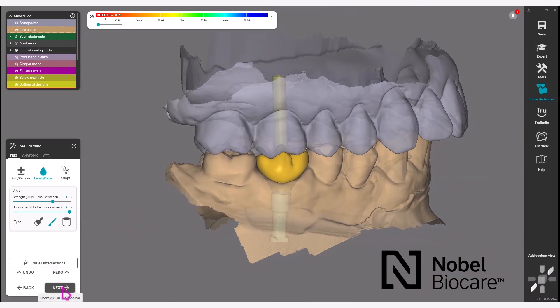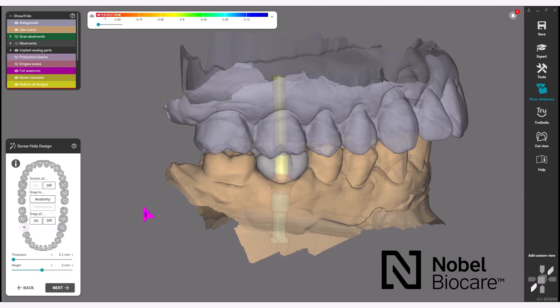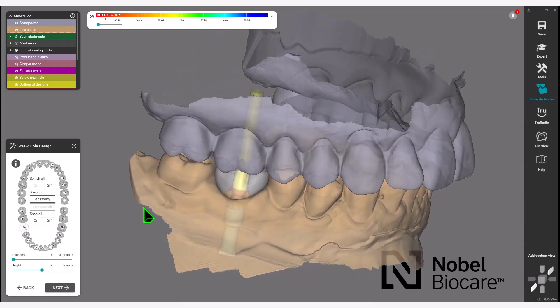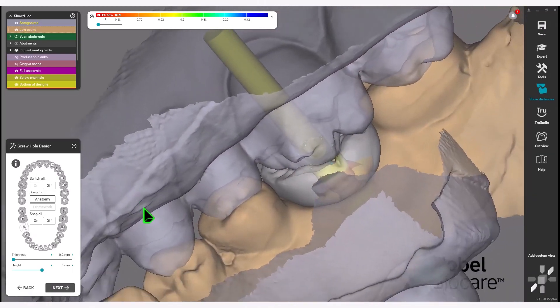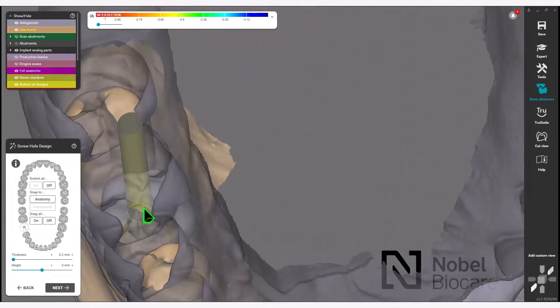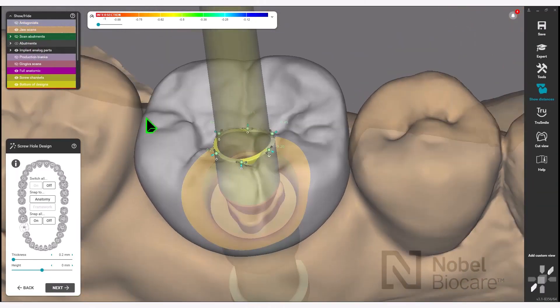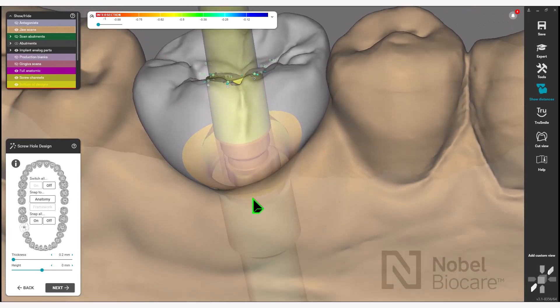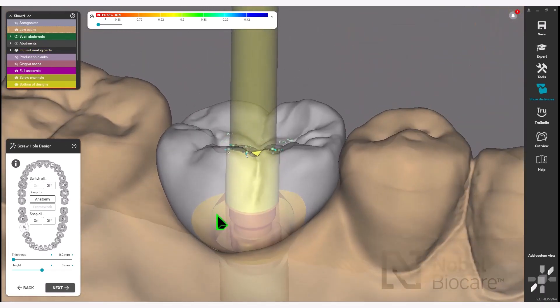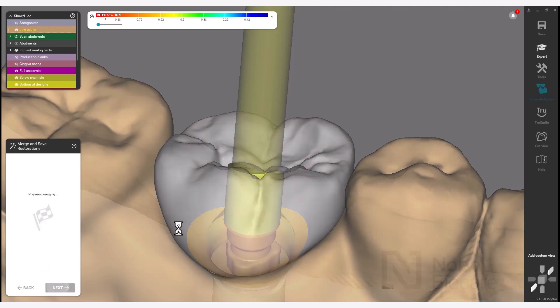Click Next to proceed in the wizard. Under screw hole design, you can adjust the size of the screw channel with these handles. Click Next in the wizard to proceed.